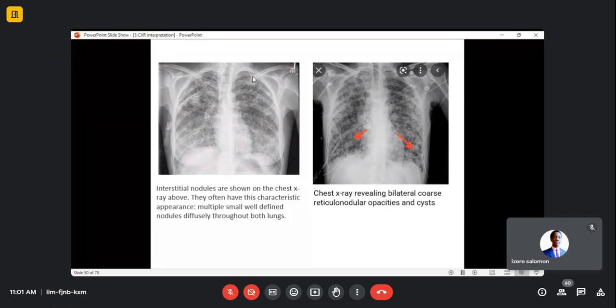Who can try to answer the question? They cannot differentiate airspace opacity from interstitial opacities.